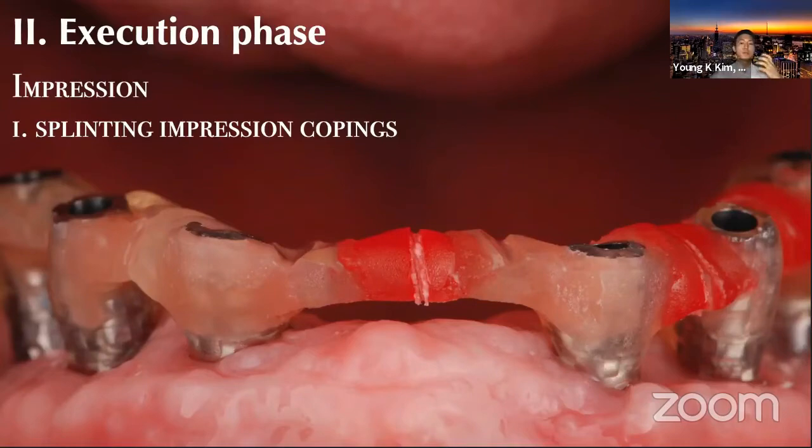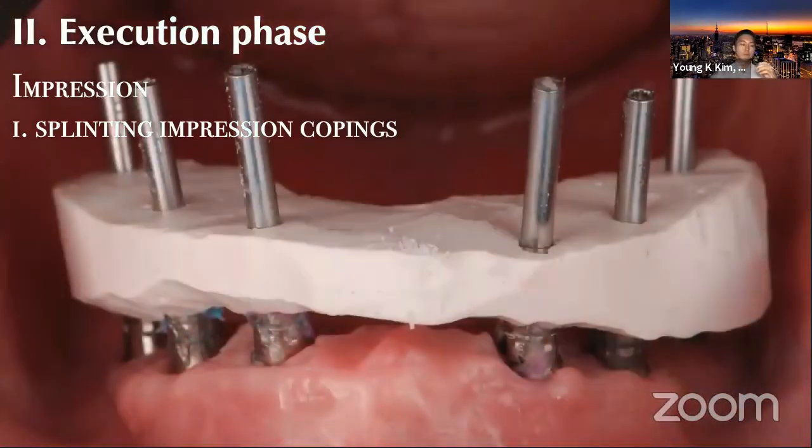And if you're using the multi-unit abutments these days in the full mouth rehab, sometimes you use a stone jig as well. This is one I created, so it's not super aesthetic, but you can request your laboratory to make a stone jig as well. If it's not fully passive, there will be a crack on the stone, and then you can re-lute them before taking the impression.